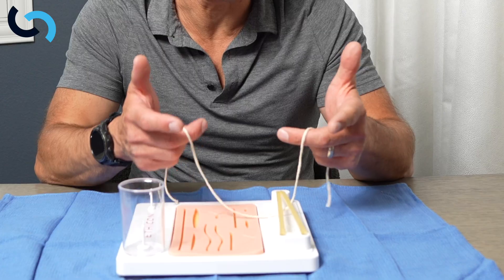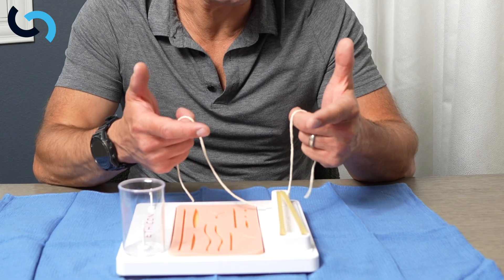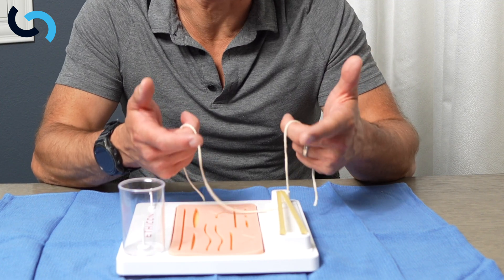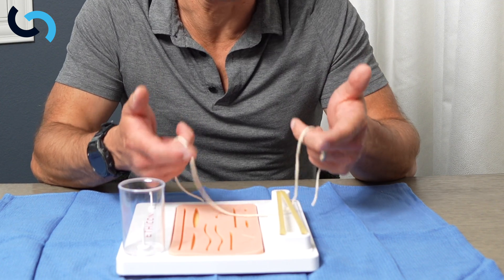When we're thinking about how to hold suture, I like to balance the suture on my middle fingers. That keeps the thumb and the index finger free, because those are the fingers that are doing all the work in the two-handed tie.